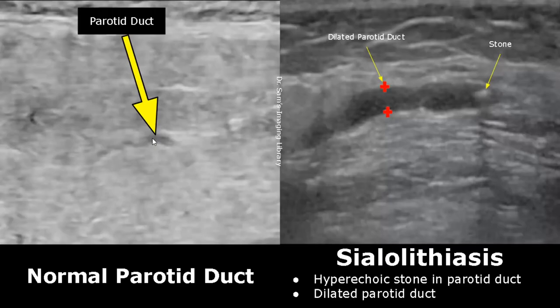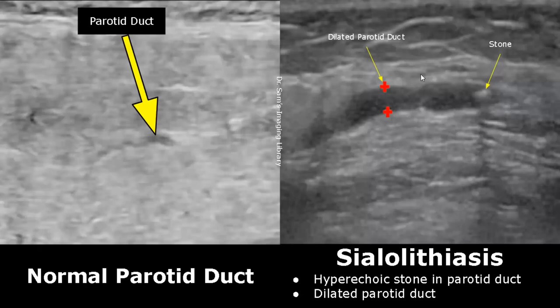Sialolithiasis refers to the presence of stones within the salivary gland ducts. We can see a hyperechoic stone within the parotid duct, which has led to a dilated parotid duct. The stone is also casting a posterior acoustic shadow.